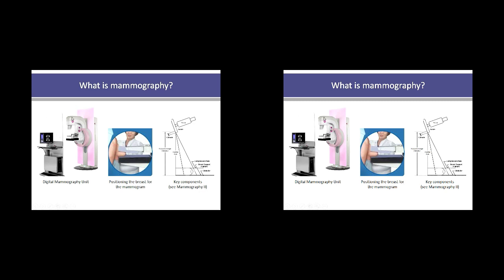So the breast will be positioned, we have an X-ray tube up here, the focus to image distance is fixed, you have a choice of multiple field sizes, and then you just take an X-ray image and a couple of projections. We only need a very small control panel. The energies used in mammography are very low. The amount of scatter being generated by the breast is fairly small. So for protection of the operator, we still need a little bit of lead glass, but not as much as we would in general or CT, for example. So that's the equipment there.